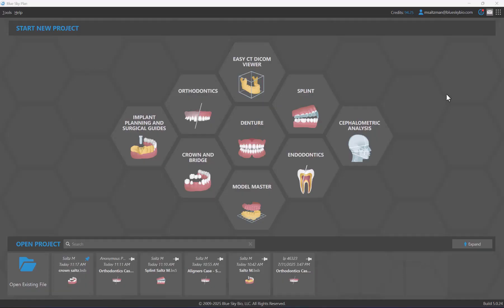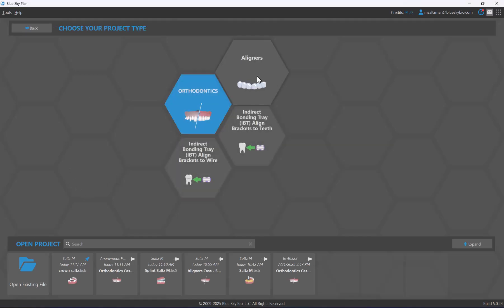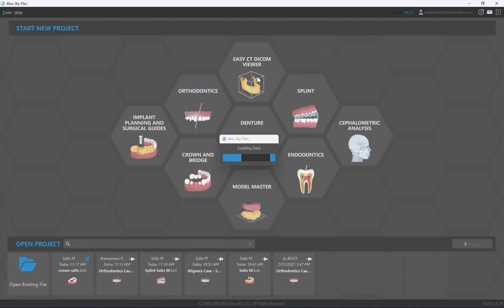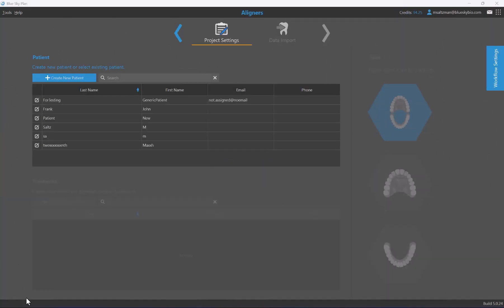We've now discussed the first of the three intro screens. We're going to proceed — I'll click on orthodontics and choose aligners, which takes us to the second screen.